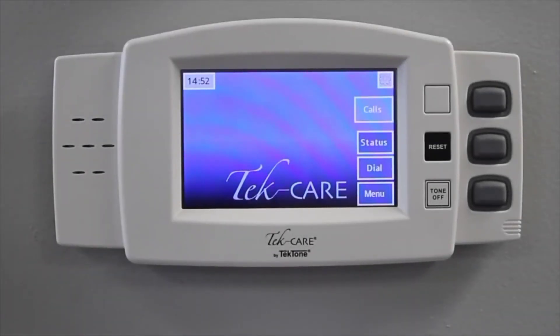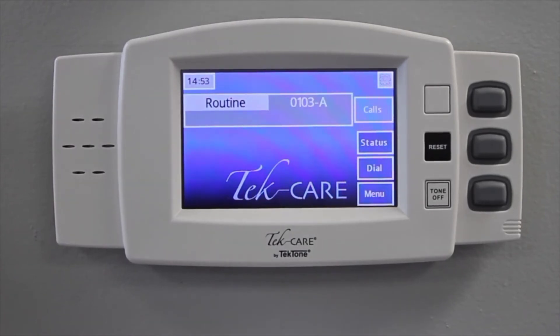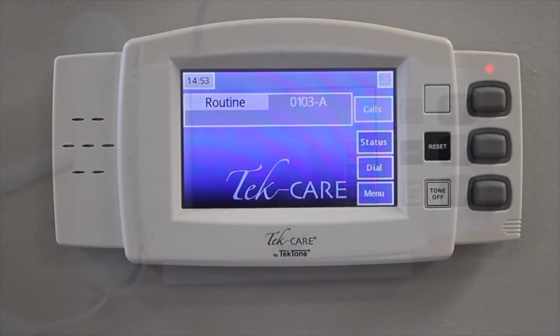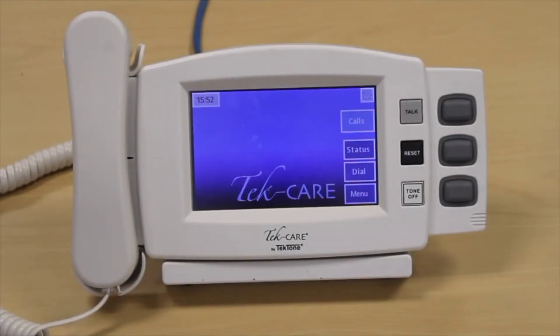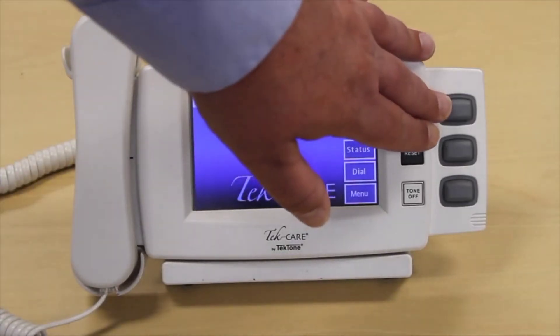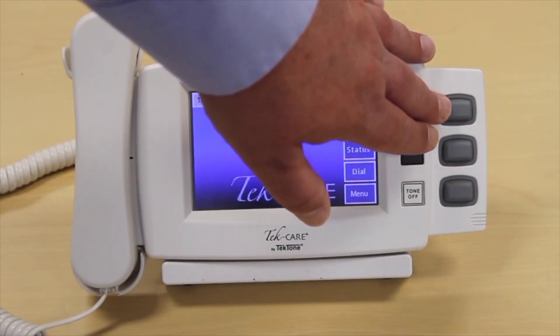Our NC415AV master station features a compact design with a 5-inch touchscreen display. The master station can be wall-mounted or desk-mounted. When calls are activated on the system, they're displayed on the master station with the call type and the room number. If high priority calls are placed, those calls float to the top. When used with one of our audio systems, the NC415AV can be equipped with an optional handset that can be used to answer calls. A push-to-talk button is also available if you prefer that method.